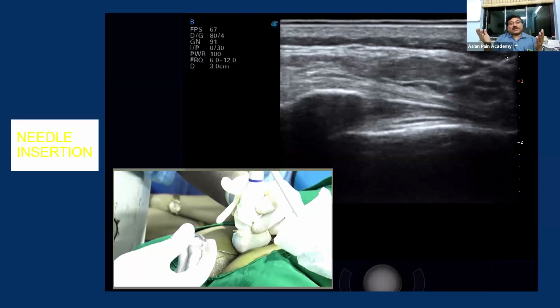Now, why does the spinal needle go into the vessels, but the epidural needles do not? Because vessels are small. With an epidural needle, usually the opening is at the side and also comparatively larger. So what happens? Usually, if it is close to the vessel, it will move to one side.